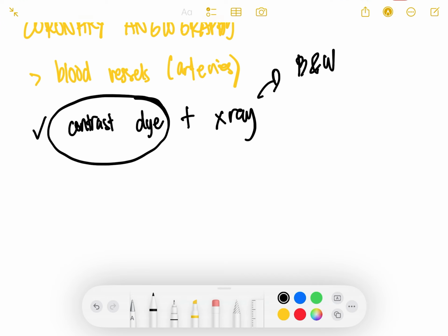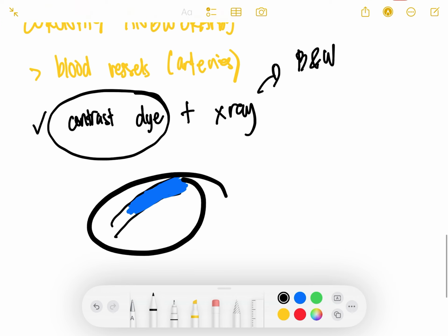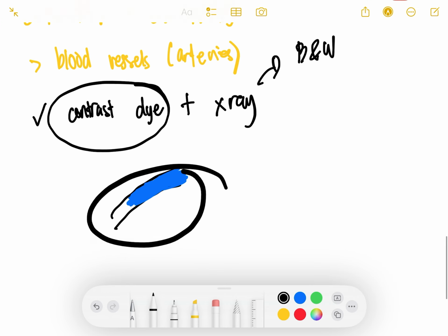So, for example, pag ito yung artery, okay, na walang contrast dye, pag nilagyan mo yun ng contrast dye, let's just imagine na puti ito ha, kasi puti ang background. So, for example, pag tinignan mo yan sa X-ray, very emphasized itong part na to. Kulay na kulay siya, very visible. Okay, so ang function yan, contrast dye is for better visualization. And then, this will produce X-ray images.